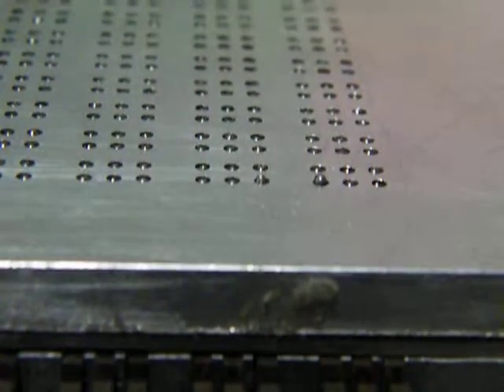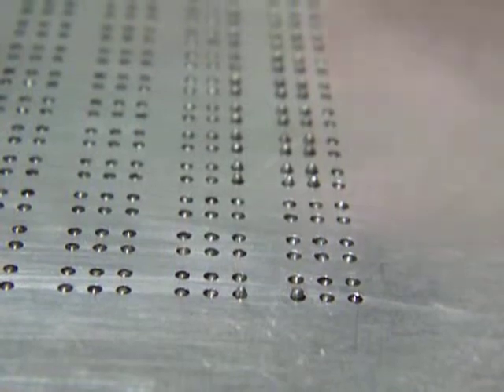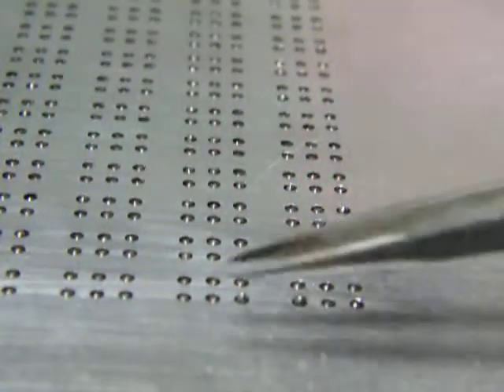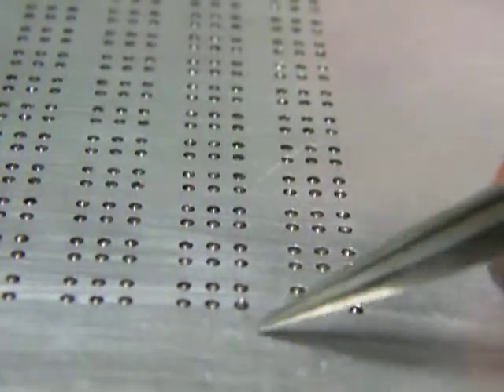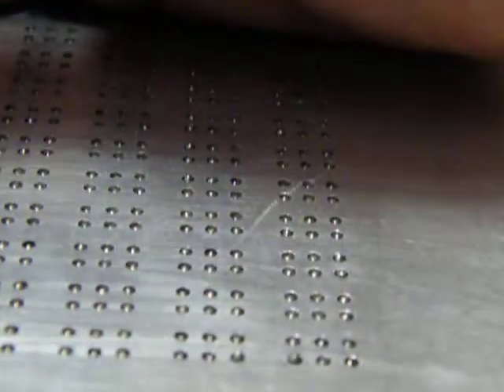I'm just trying to show you. Can you see them? You can just about see them there. Okay, so even when you use these other things, you can see there's no activity on these cells. They are latched shut, but all the rest are latched open. So you can see you can trigger all the pins. But even when you remove the actuation, these two pins were latched in the positions that they were set. Now we want to do it with the second column.